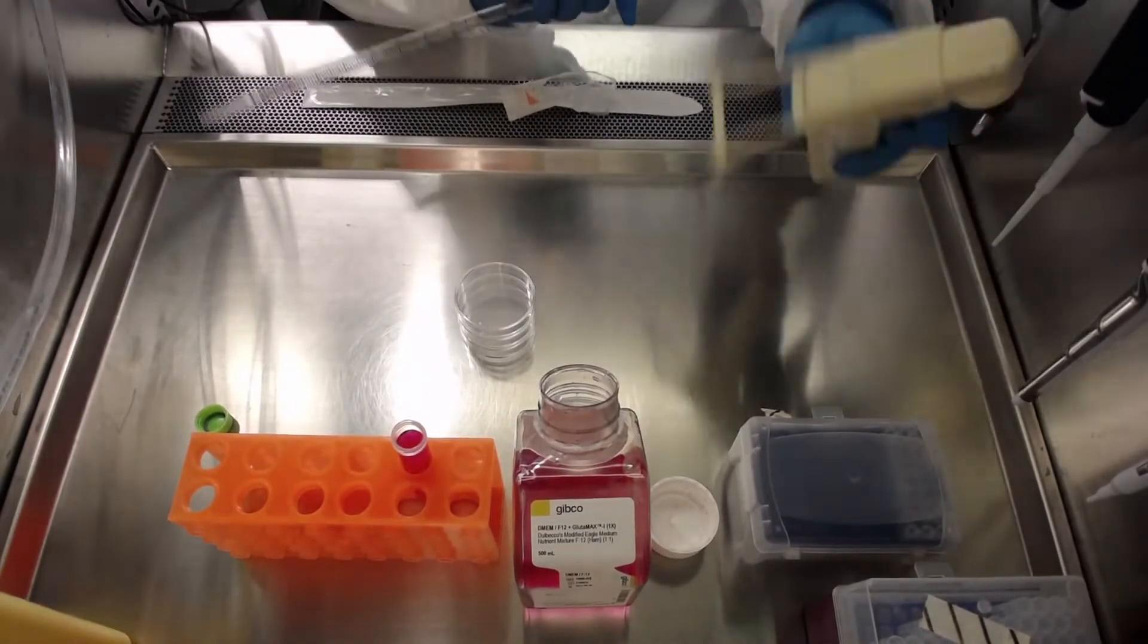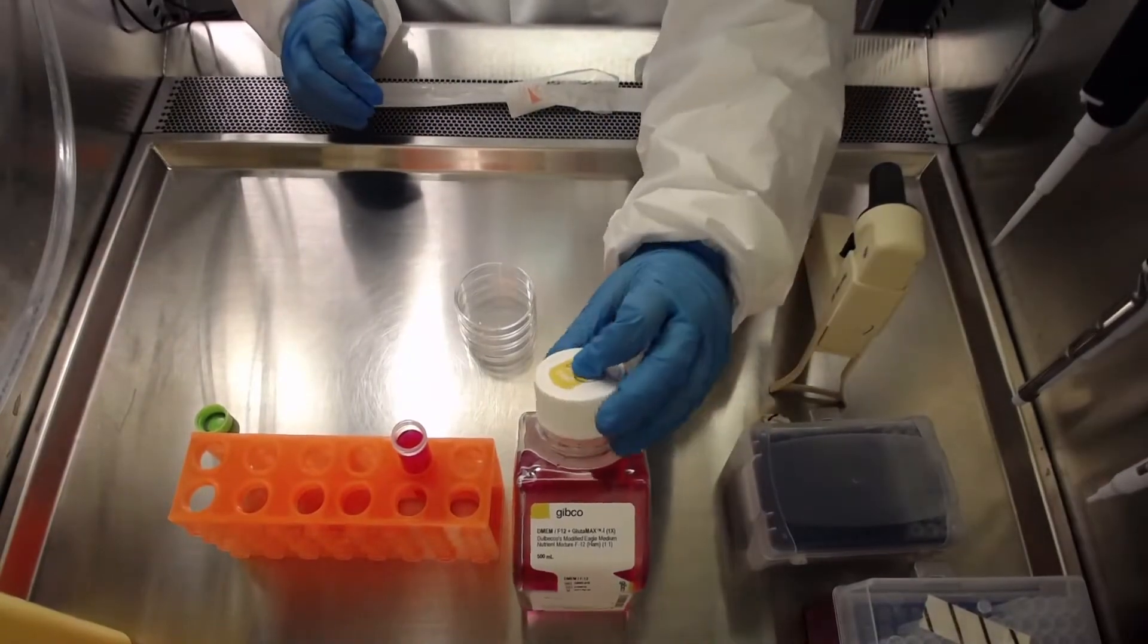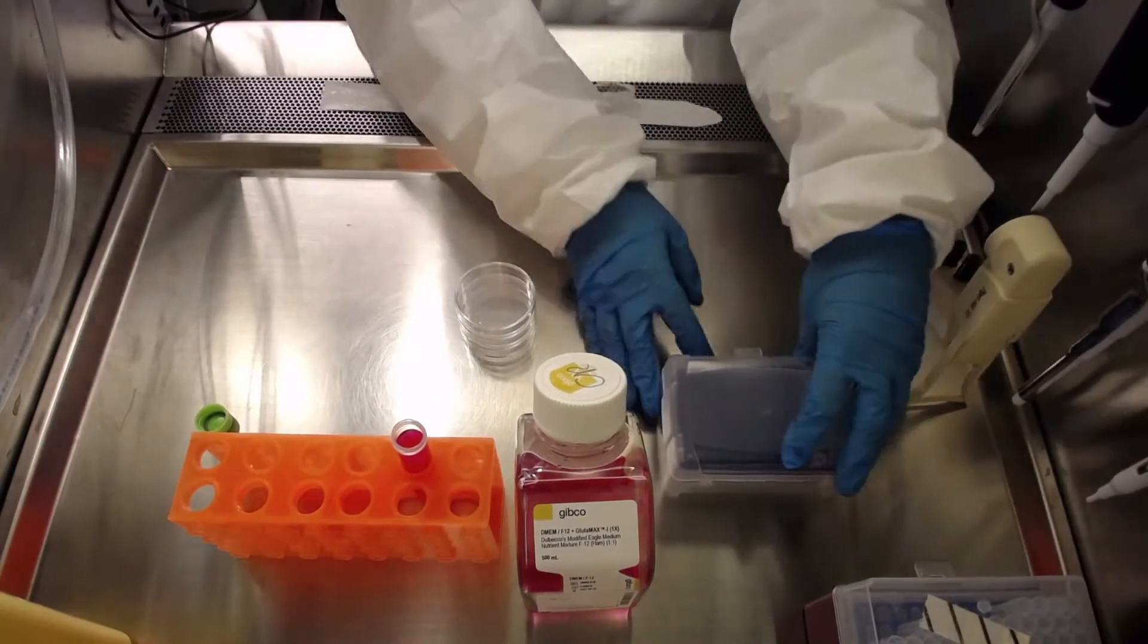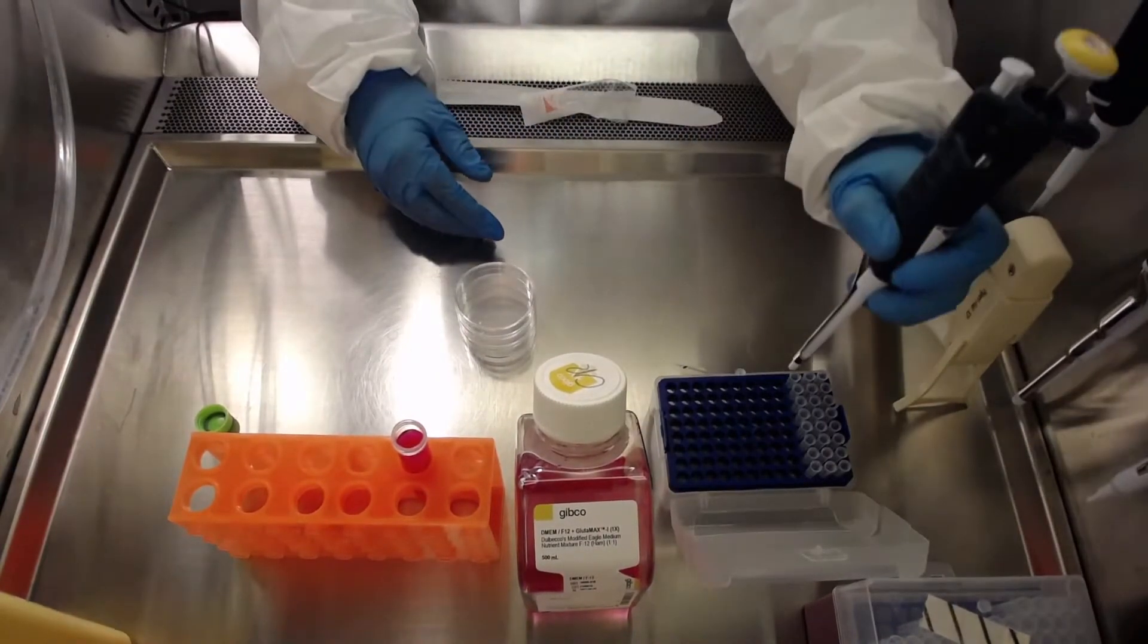As mentioned, matrigel matrix is sensitive to temperature and will start to form a gel at 10 degrees Celsius and will also rapidly gel at temperatures over 22 degrees Celsius.